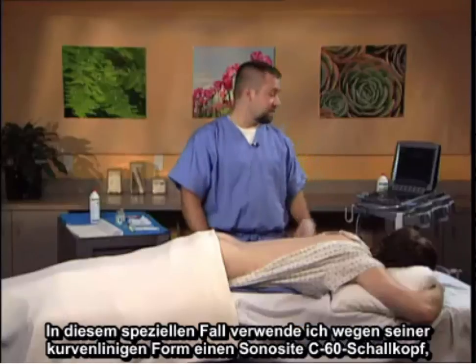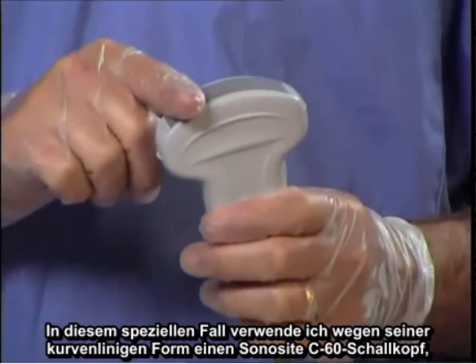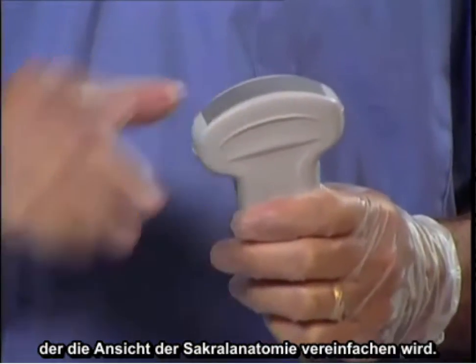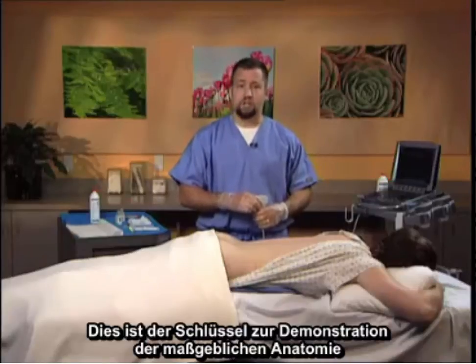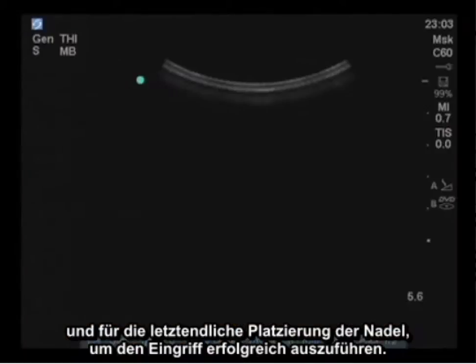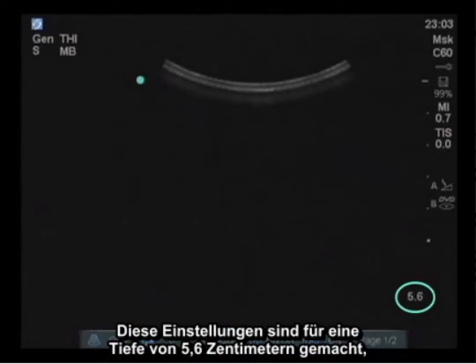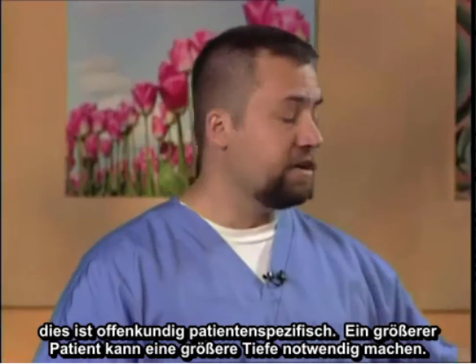In this particular case, I'm going to be using a SonoSite C60 probe because of its curvilinear shape, which will facilitate viewing of the sacral anatomy. This is key for the demonstration of the relevant anatomy and ultimate placement of the needle for successful completion of the procedure. The settings are set for 5.6 centimeter depth. Obviously, this is patient specific. A larger patient may require a deeper depth.